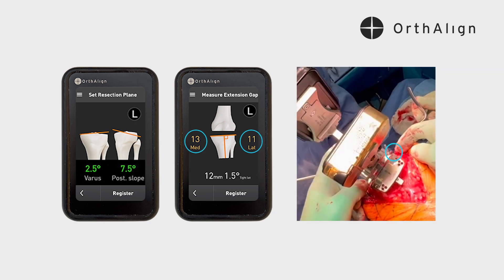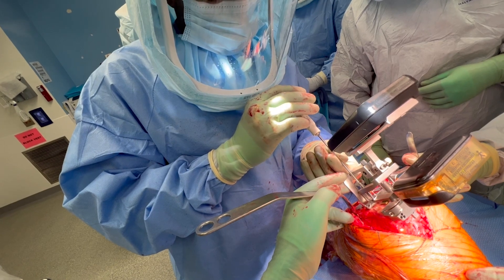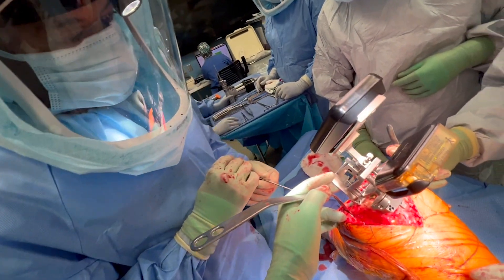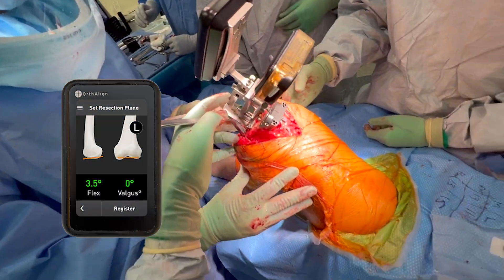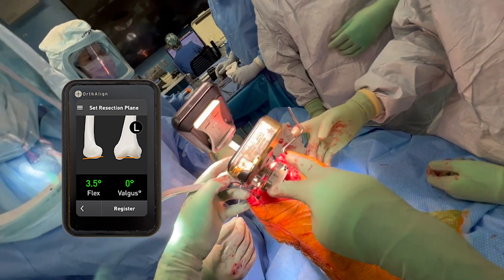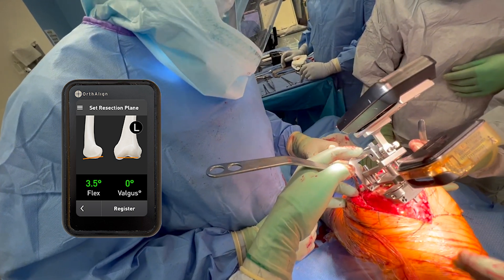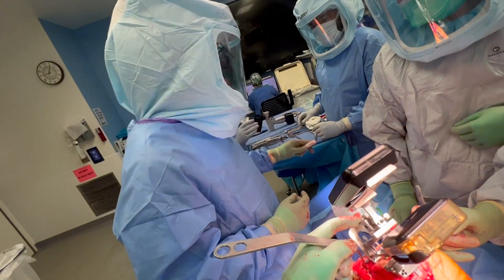When I put those paddles down, it's sitting proud on the medial side by about four millimeters when it's already touching down on the lateral side — that's going to be too much of a correction and it's going to make her too tight on the medial side. Therefore, I'm just going to turn the cutting block into a little bit more varus until I see that space close down. I want it to sit proud by about two millimeters. As you're turning the screwdriver, you can see on the screen what it's doing to your alignment. I can see I'm now at zero degrees of valgus and the distal femoral paddle is two millimeters proud. This will give me a balanced extension space — the knee is at zero degrees on the femoral side and two-and-a-half degrees on the tibial side, leaving a residual slight varus alignment. To me that's perfectly acceptable; it helps balance the knee.